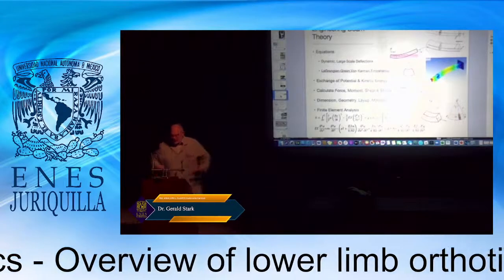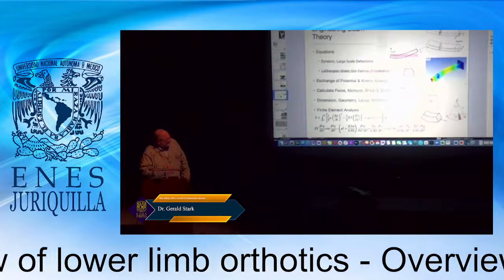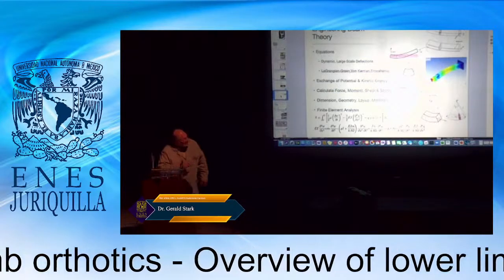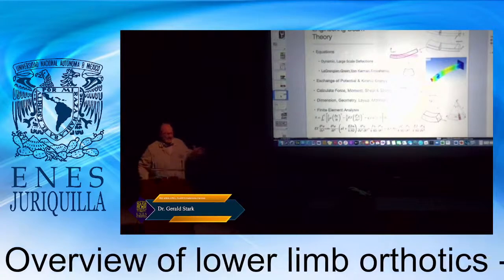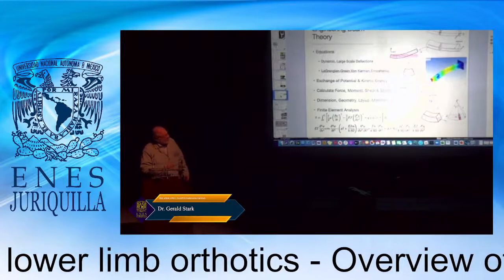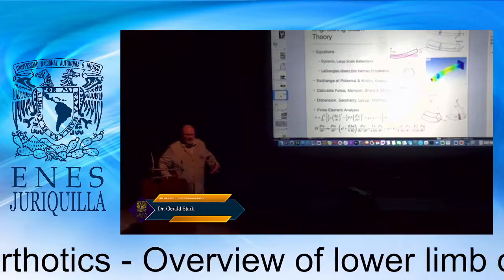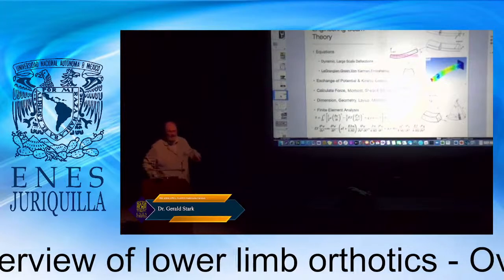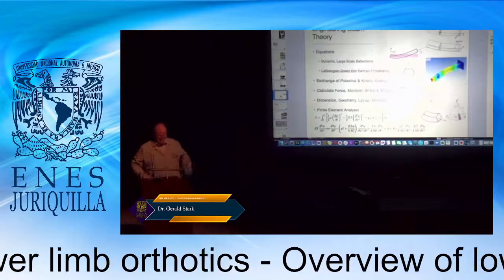So in engineering, what we try to do is base this on engineering math. You don't have to understand this necessarily. Some of you, I'm sure, do. But with the cantilever, it has to build up enough potential energy to develop that resistance. Now, your human foot doesn't need to do that because it has the use of variable power of the muscles. But with prosthetic feet, we rely on this cantilever. The issue comes if we haven't been able to build up that deflection enough, we have to have movement at the toe to have enough resistance. So if the patient doesn't have their weight over their toe, they can't necessarily experience that.